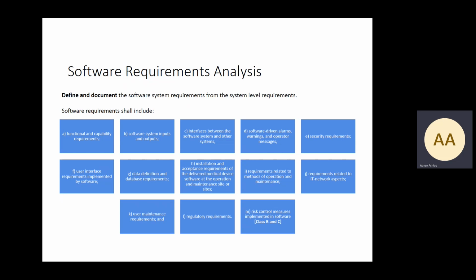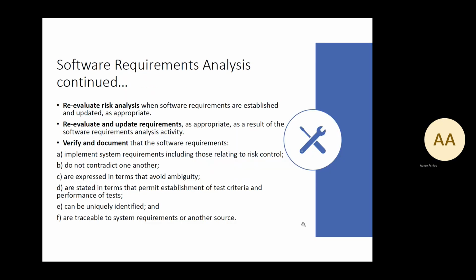And then finally, risk control measures implemented in software, which again, as I said before, is only mentioned for Class B and C.